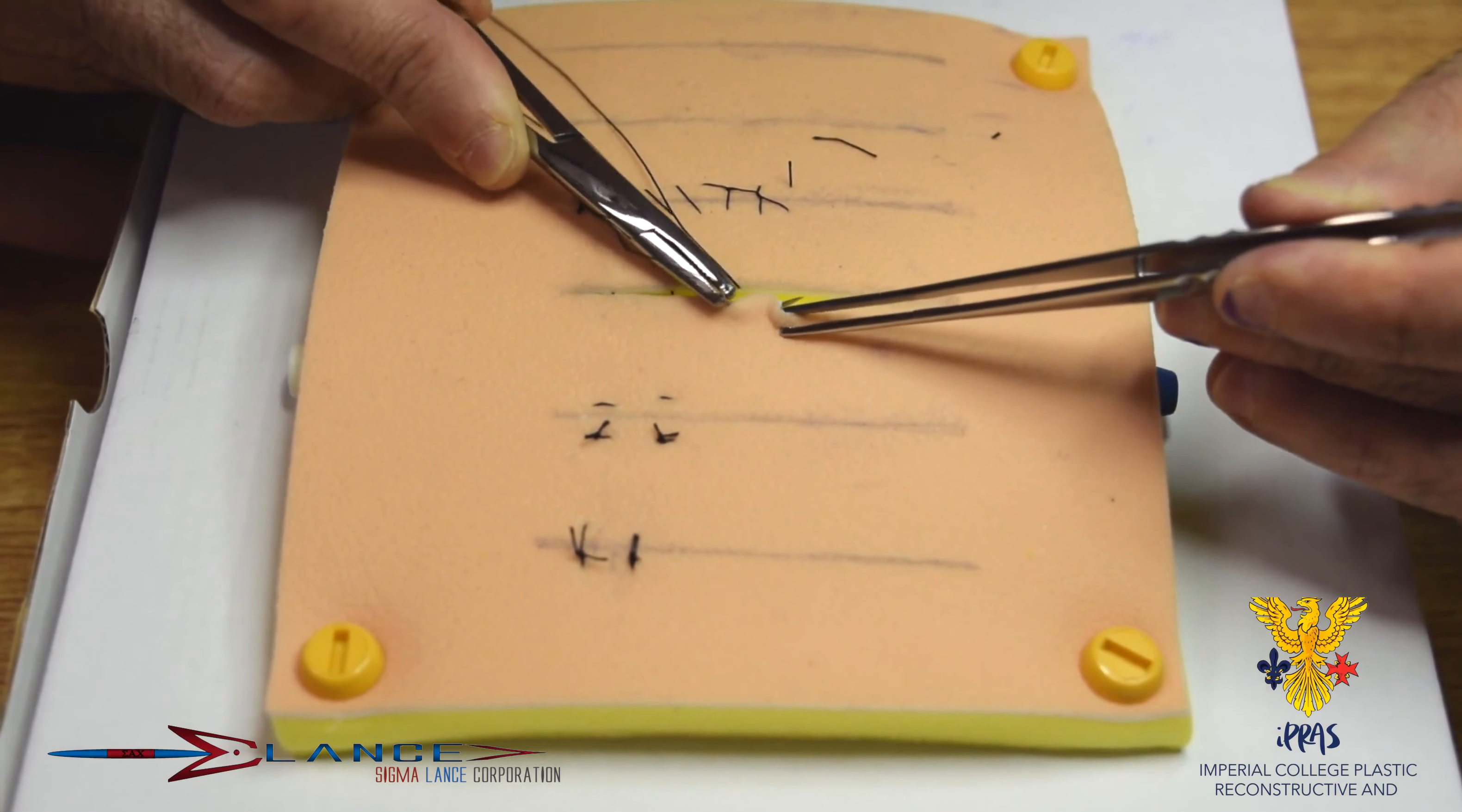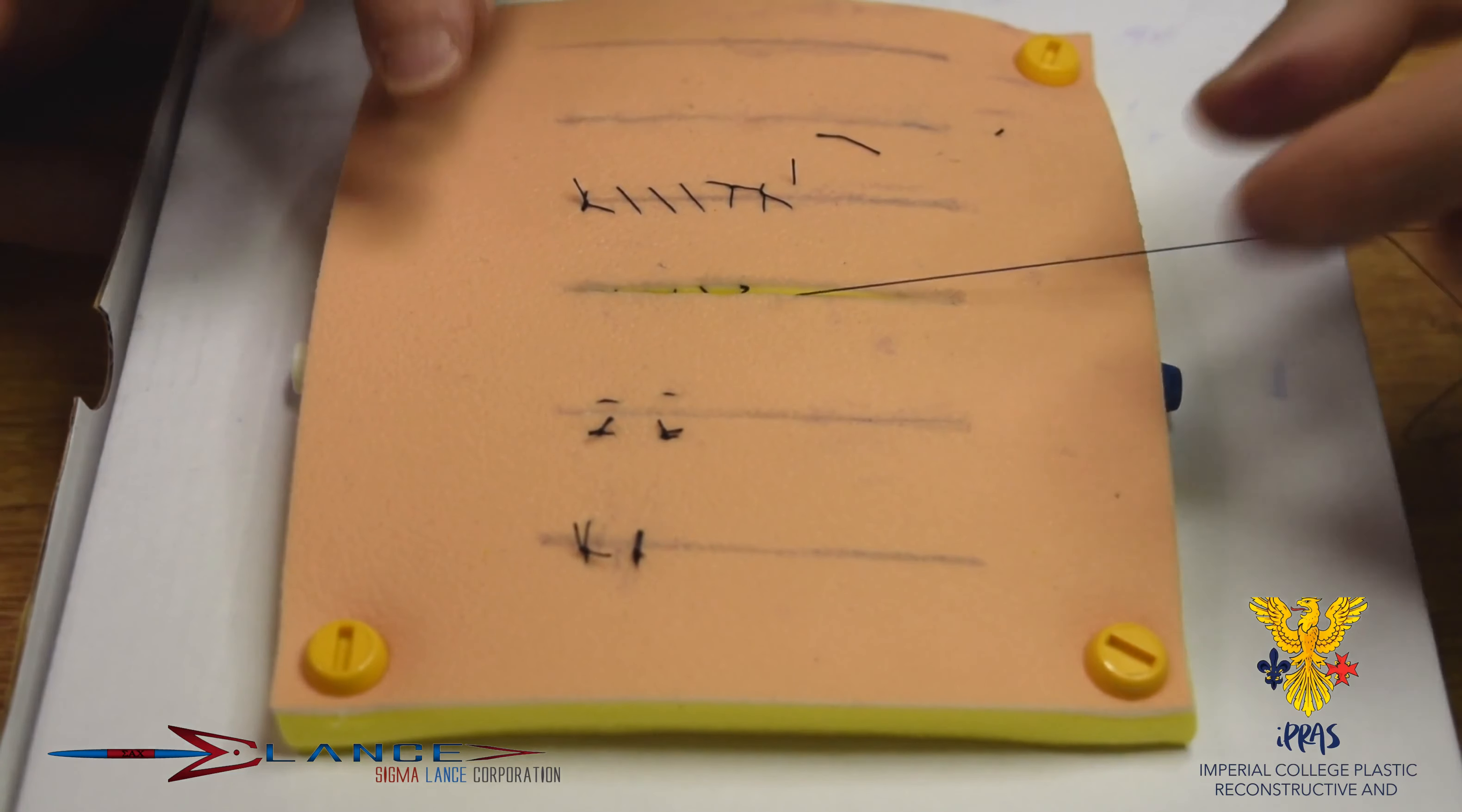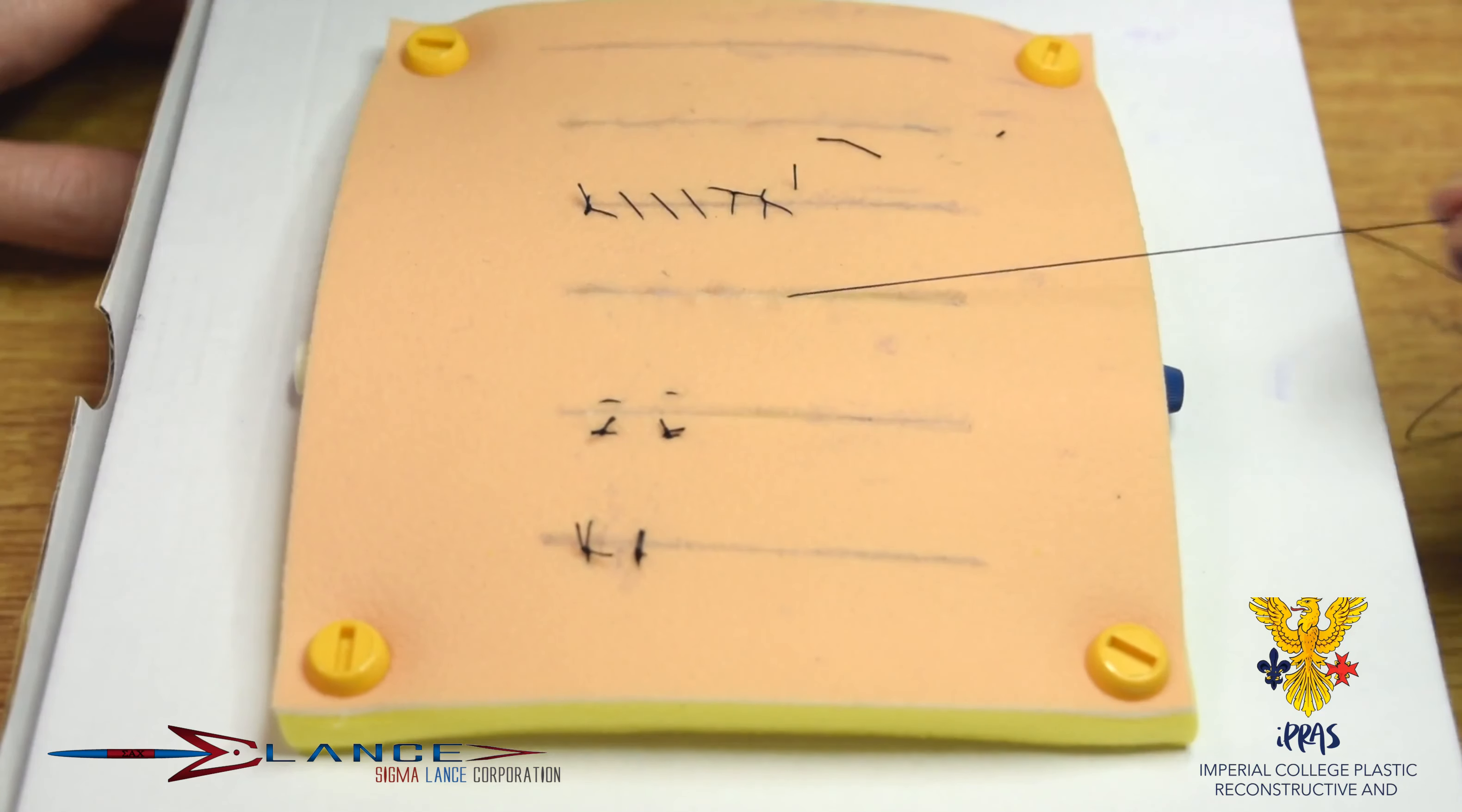And it shouldn't be square, it should be slightly zigzag, exactly like I'm showing, because the next stitch is slightly behind the other. And here it is, and I'm going to pull it through. And that closes away.